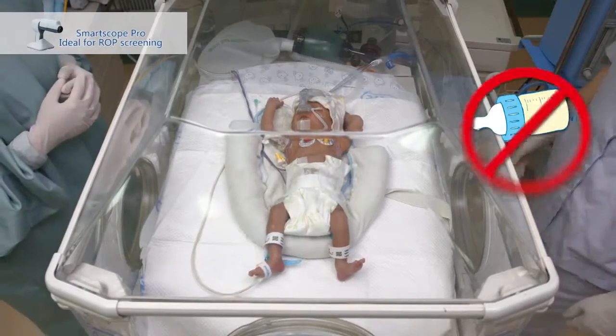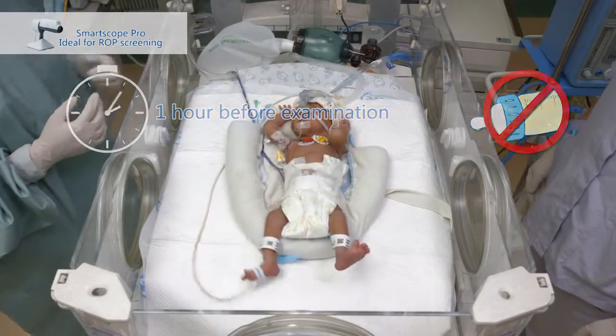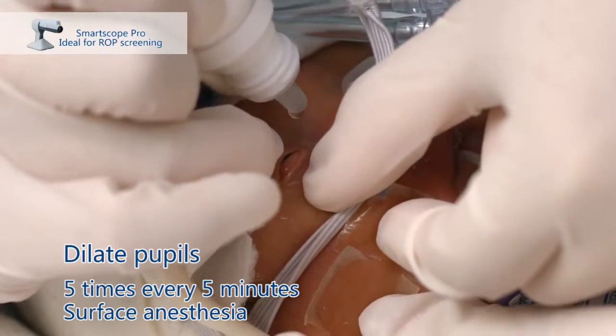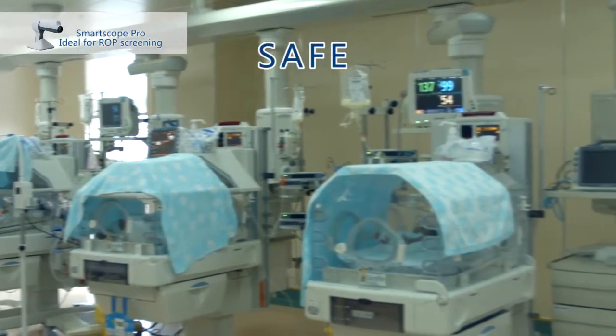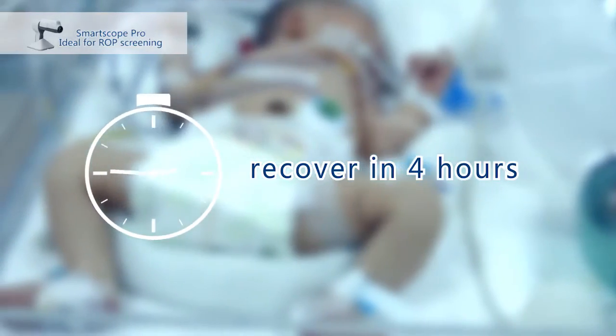Don't feed any milk or water for 1 hour before the examination. Dilate pupils with dilating drops 5 times, every 5 minutes, before examining. Surface anesthesia can be given. Anesthesia and dilating drops are safe to the infant. The dilated pupils will recover in 4 hours.